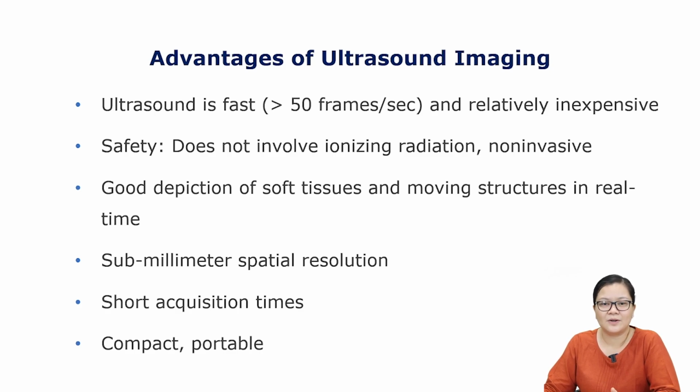For example, in ultrasound Doppler imaging, you can use this type of mode to be able to detect flow of red blood cells in the blood. And so this allows the structures to be viewed in real time.